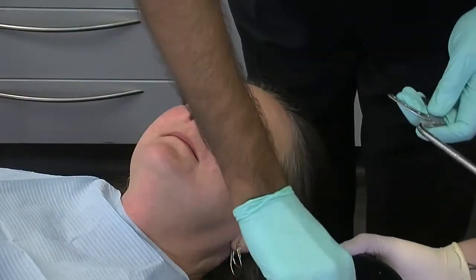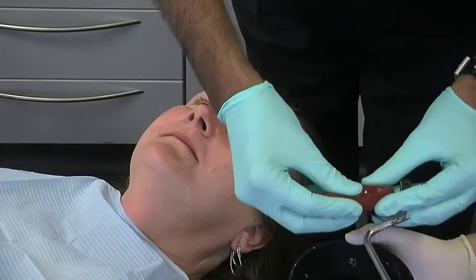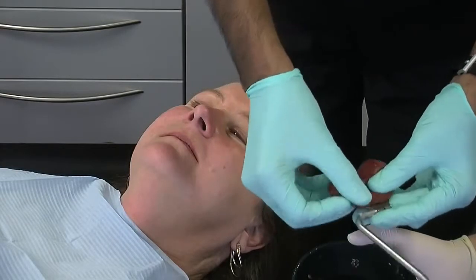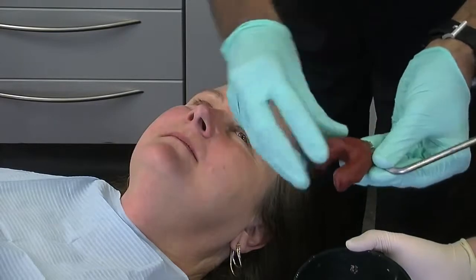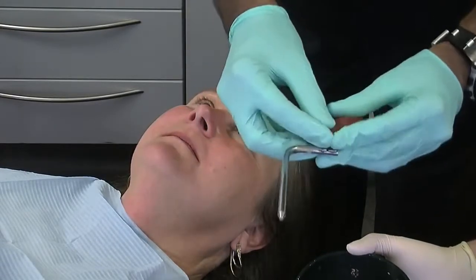We're going to take a facebow record now. My preference is to use composition — this has been warmed up in hot water — and I'm just going to take the bite fork and put the composition here like this.